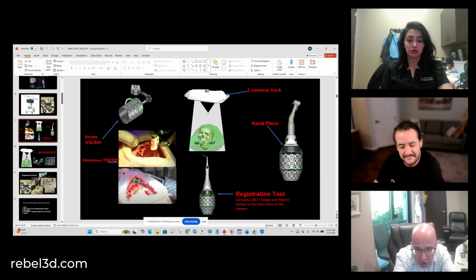The jaw here is actually your stored map. On this stored map that we used previously to build on it, it's the map that you have, which is the CT scan, and you put on it the implant, and you put on it the teeth, and you did everything that you wanted to do to draw back the map the way you want it, with the same landmarks.